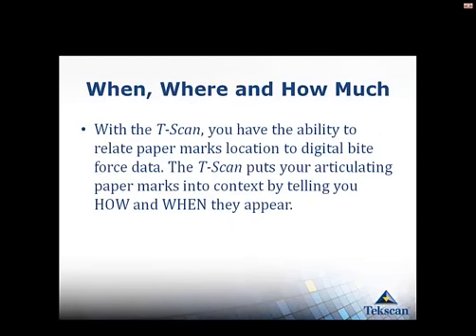So what we're looking at is with T-scan. T-scan doesn't replace our traditional means, but what it does is it puts your articulating paper into context. So when you're looking at all those marks, it tells you when that mark came in and how much force is on that mark. And that's been really helpful in our dental practices that are using T-scan.